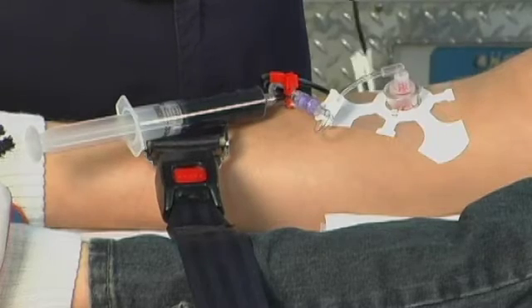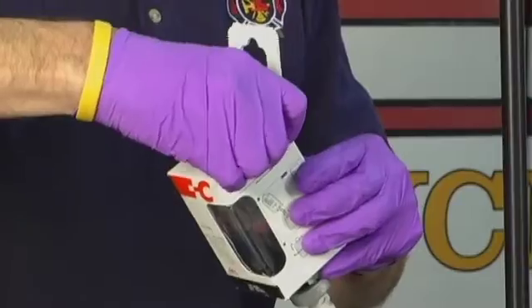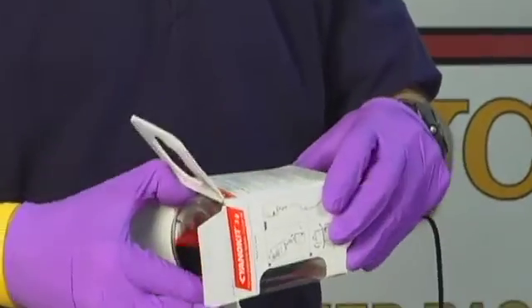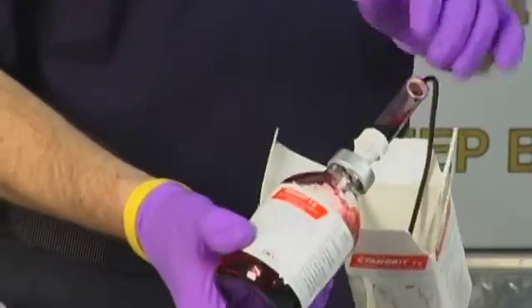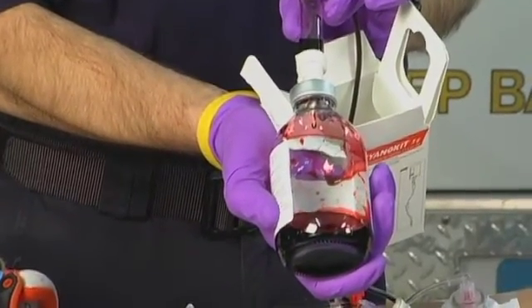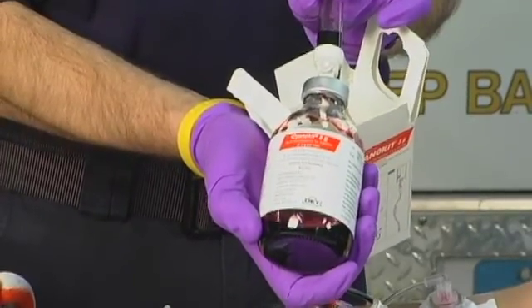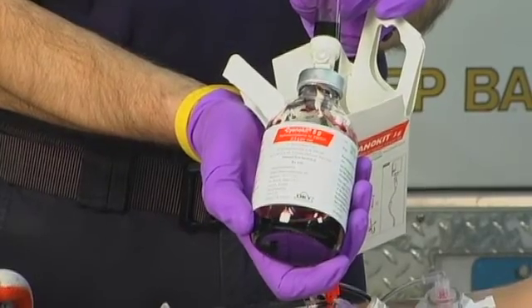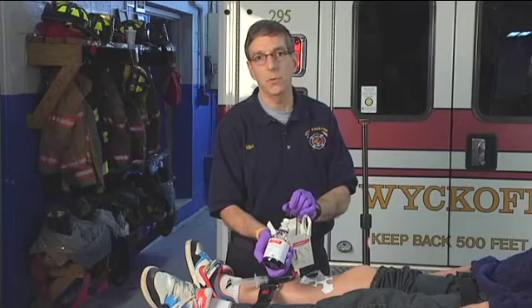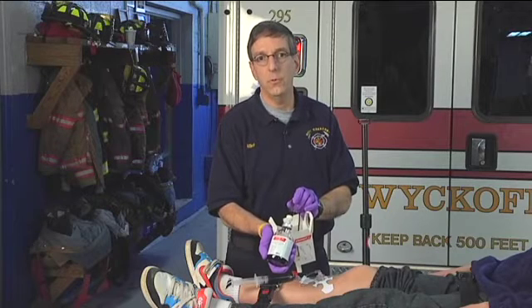Inside this cardboard box is a glass bottle holding the hydroxycobalamin — you can see the dark red color of the medication. The glass bottle is labeled with the name: Cyanokit, hydroxycobalamin, and this is a two-and-a-half-gram bottle. For an adult, two bottles for a total of five grams is the normal dose. For a child, follow pediatric dosing based on your local protocols.